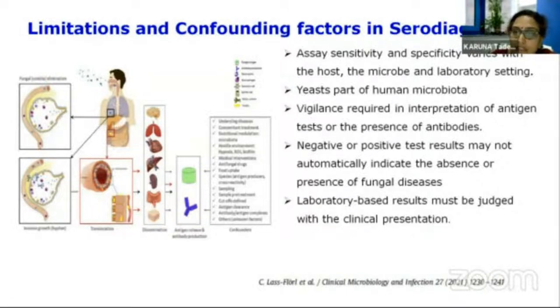They have to be interpreted with the background of the clinical history, the microscopy, the culture findings, and histopathological findings. So these are very, very important to understand and to report the serodiagnostic tests.